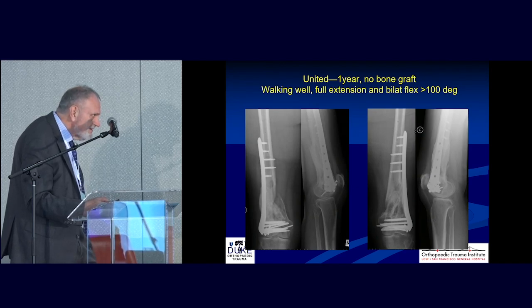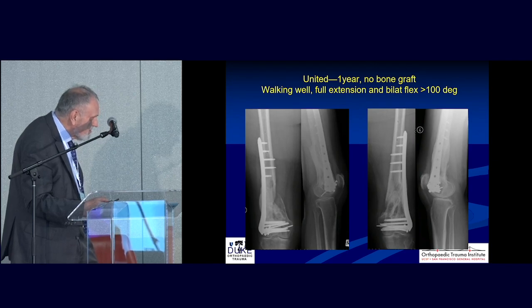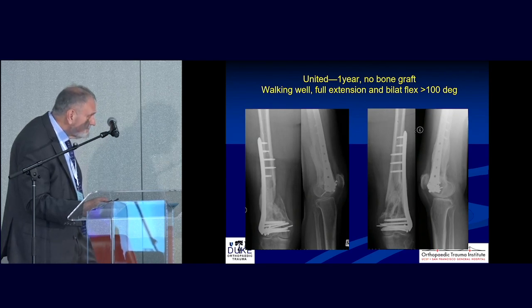Is this a 13 hole? Because it looks really short. I'm not sure what length it is, Kyle. Could be. It looks too short. I would have gone with the long, always go long. You would have gone with a longer plate, maybe more pins, more screw spread. Yeah, more spread. Much longer. Well, this wasn't done this year, so we didn't know that back then.